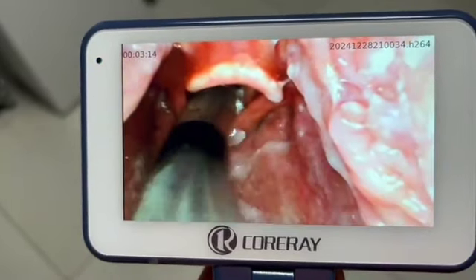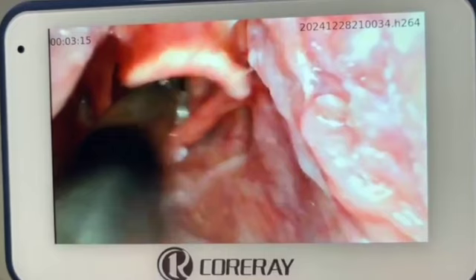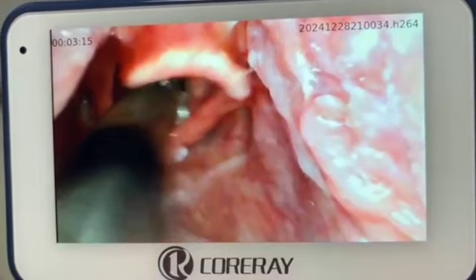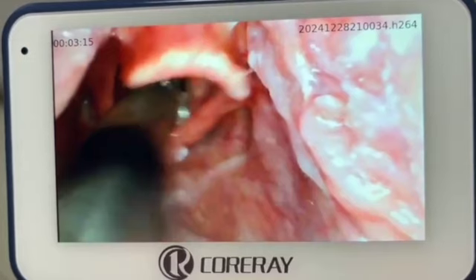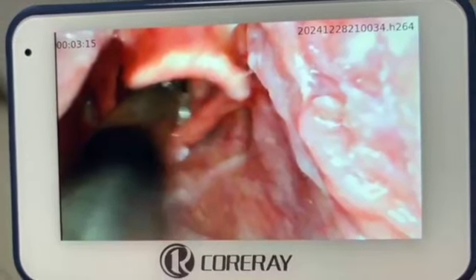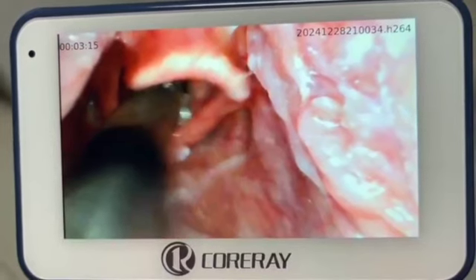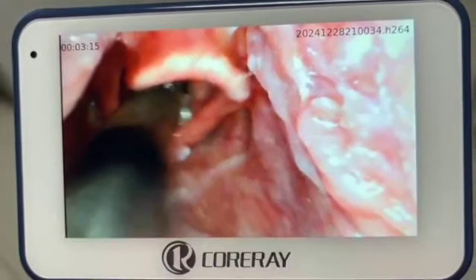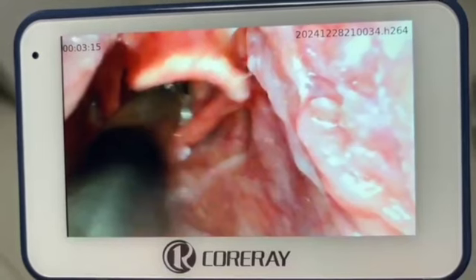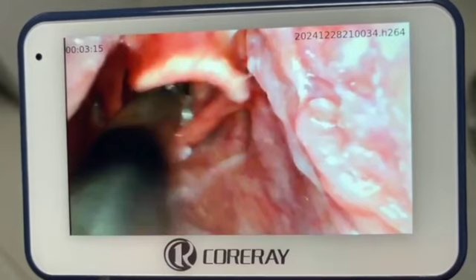The next mistake, and it's insane how quickly these mistakes can line up on top of each other, but the next mistake that I made was when using the hyperangulated blade, you need to use the hyperangulated introducer, and the introducer is very rigid. It's not designed to be bent or changed. The idea is that it follows that hyperangulated blade perfectly so that it gives you the easiest insertion. The challenge with that is that as you get the tip of the tube into the airway, that introducer sort of stops the tube from being able to advance.